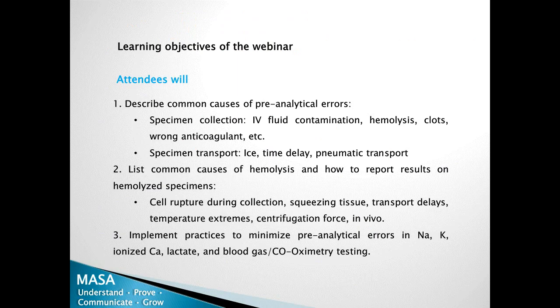Returning to the learning objectives: Dr. Toffoletti has described common causes of pre-analytical errors in specimen collection and transport, listed common causes of hemolysis and how to report results on hemolyzed specimens, and presented how to implement practices to minimize pre-analytical errors in blood gas analysis.